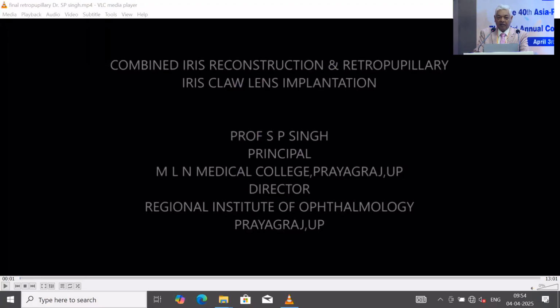As you know, nowadays retropupillary iris claw lenses have increasing popularity among general ophthalmologists as a very simple, very short procedure that can be implanted in any situation. But the posterior iris claw lens needs sufficient iris support, as well as ideally a normal pupil, normal shape and size. However, the lens can be implanted in minor iris injury, as well as a dilated pupil.